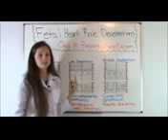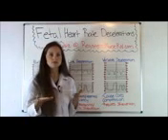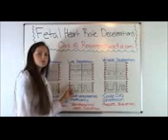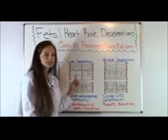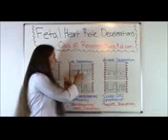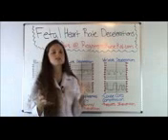Next is late deceleration. The key with this is you once again want to look at mom's contractions and see how baby's heart rate is responding to mom's contractions. Our baby's heart rate is starting out in the 150s. That's normal. And we see that mom has a contraction. But whenever mom has a contraction, baby's heart rate isn't really responding until after her contraction ends. Here's her contraction, and then baby's heart rate goes down. And we notice that again. Mom has a contraction, baby's heart rate's still at baseline, not really responding, and then it responds after mom's contraction. This is concerning. This is not normal.